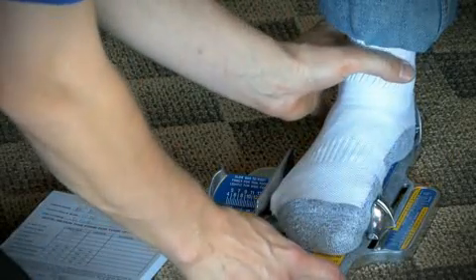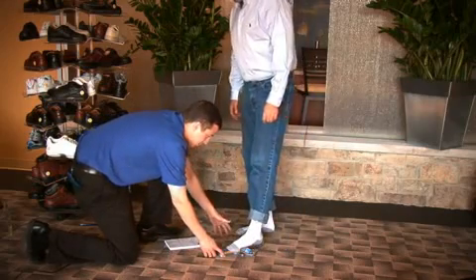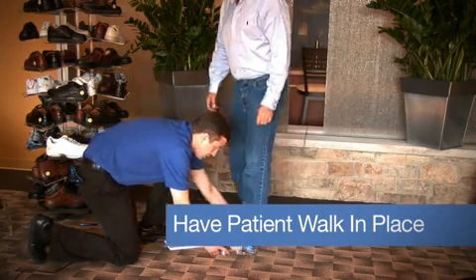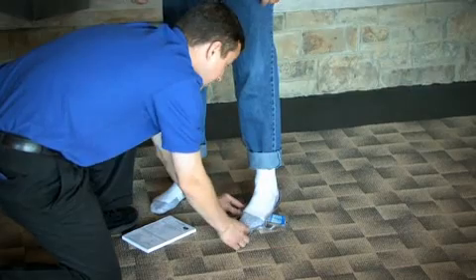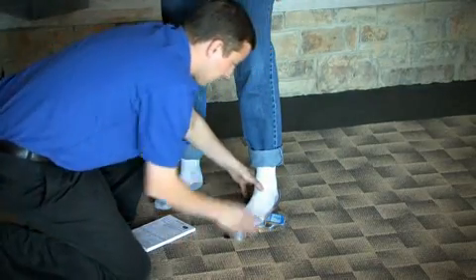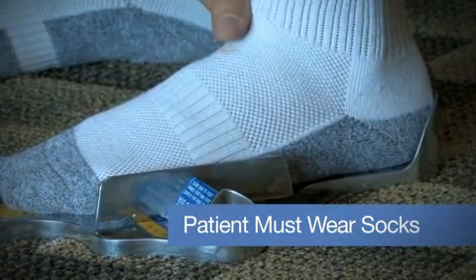From there, we'll lift the Brannock up after we've indicated that, and then we'll go to the left foot. Again, have the patient walk in place. Once he's walked in place, we're going to try to get him as close to that angle that he was at. And again, feet shoulder width apart. This is also a good time to indicate that he or she should be wearing socks at all times.